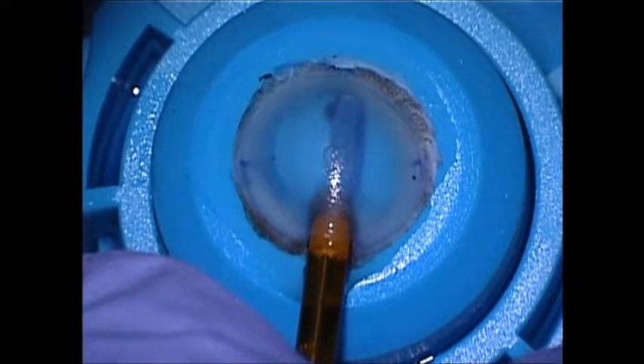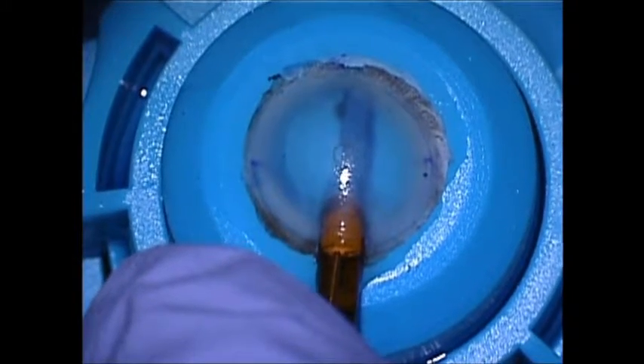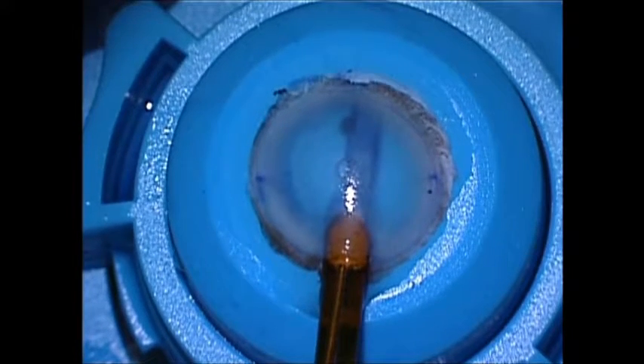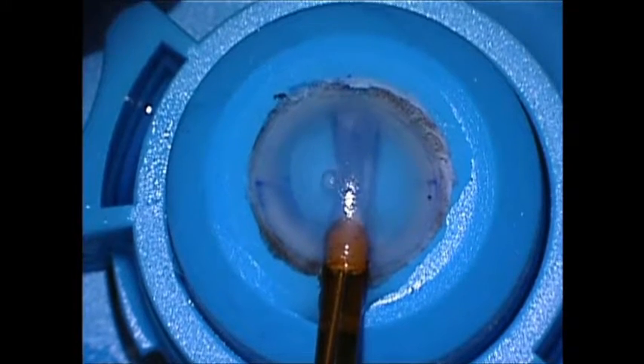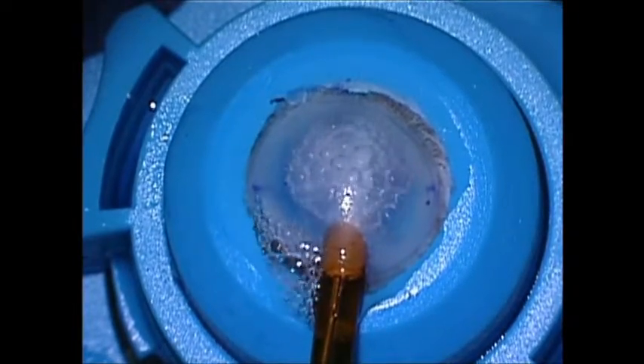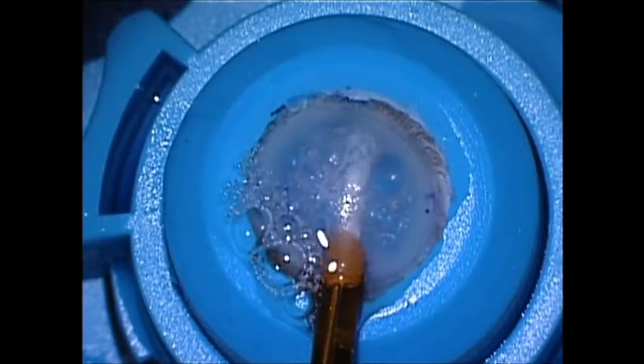Air is injected through the inner cylinder, which unfolds the tissue and pushes it downward to the surface of the iris. After it's unfolded completely, the known orientation places the endothelium side down against the iris.